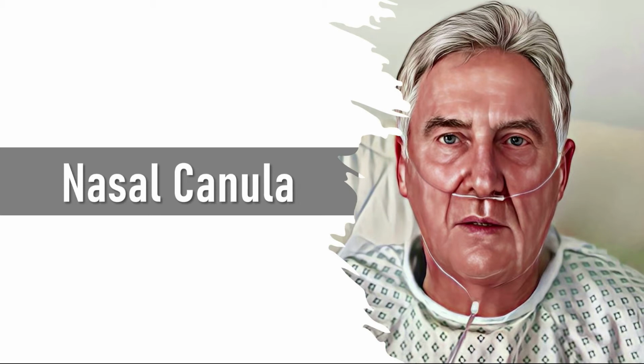That fresh gas is 100% oxygen, so what comes out of the nasal cannula is always 100% oxygen. What is adjusted is the flow of oxygen. The gas, because it's coming straight out of the wall, is not humidified, and it is believed that moderate levels of non-humidified gas into the nose are well tolerated because the patient is able to humidify that gas themselves.